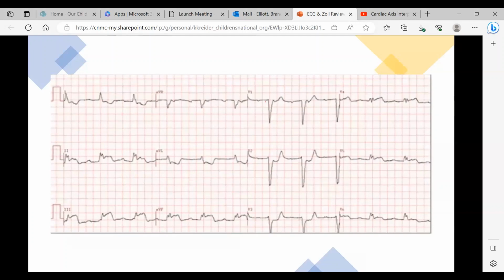So it looks regular. It looks nasty. Definitely 2 and 3 have elevation. And is that a bundle branch block too? Yep, that's why I put them back to back, because then you can see you definitely have a bundle branch block, but you definitely see that ST elevation in this picture. And in AVF.